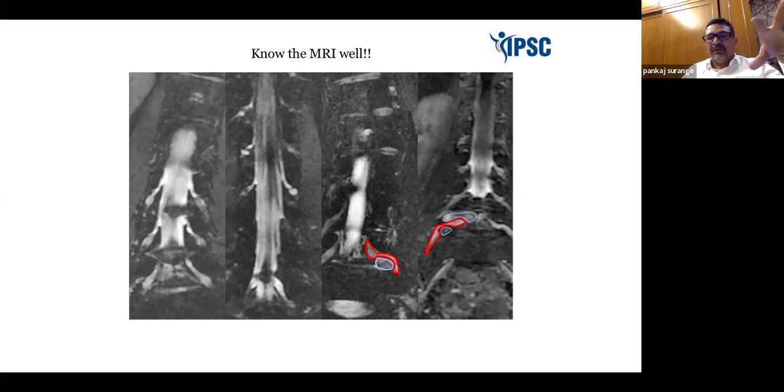That is also called a laminotomy or a facetotomy. We might have to remove the inferior articular process or the superior articular process, some portion, not the entire portion. We want to preserve the stability. We don't want to do much destruction. The idea is to preserve the natural structures, the ligaments, the facet joints and the bones.